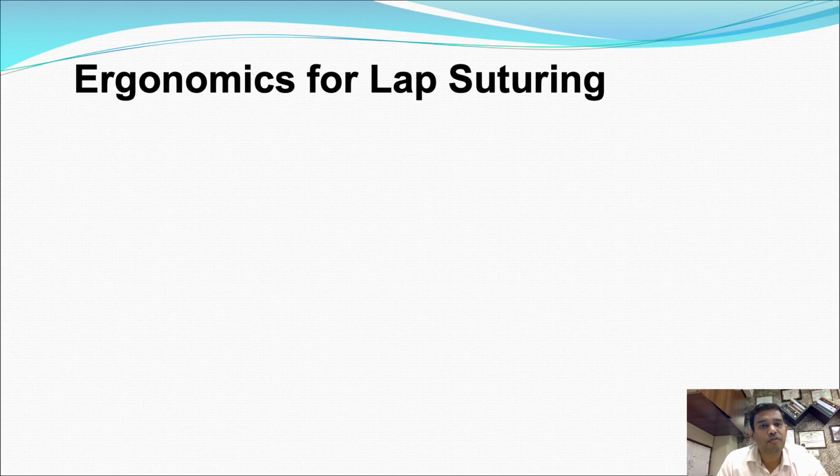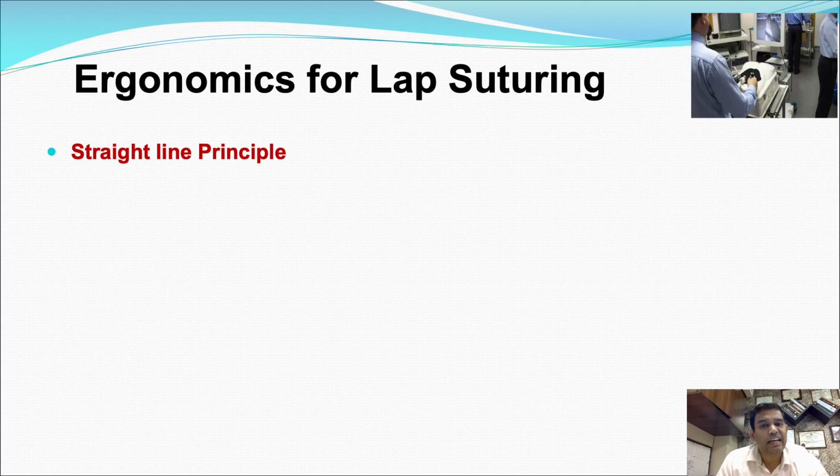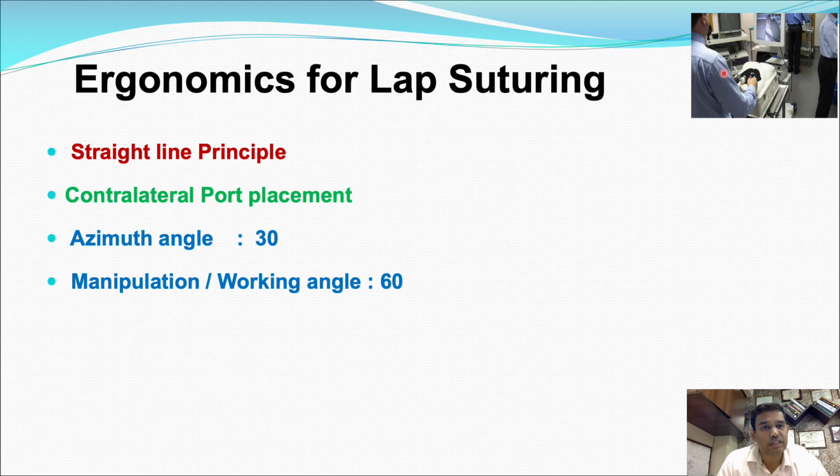Coming to the ergonomics of laparoscopic suturing. First important thing is the straight line principle. What does the straight line principle mean? It means the surgeon, the pathology and the monitor, all three should be in a straight line for a better ergonomic position and better suturing. Second is port placement. You should have a contralateral port placement.